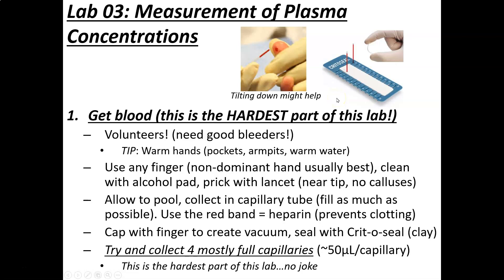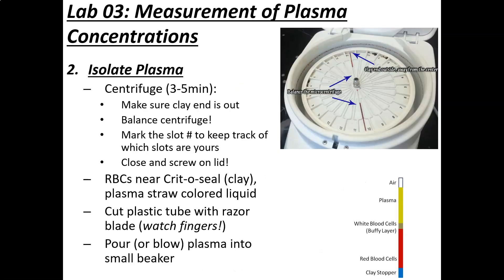You want to try to fill four complete capillary tubes if possible. Then we want to isolate the cells from the plasma. The cells collectively are called the formed elements — most are red blood cells, but there are also white blood cells and platelets. To do that, you centrifuge the tubes. Take the clay end and stick it to the outside corner of the centrifuge. It's important to have the clay end to the outside.